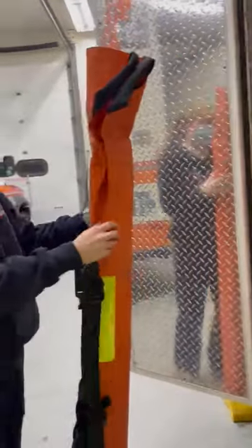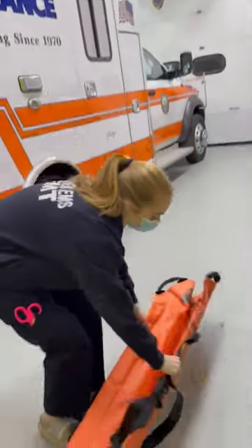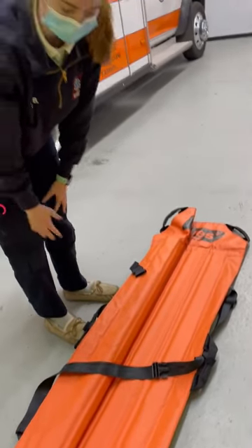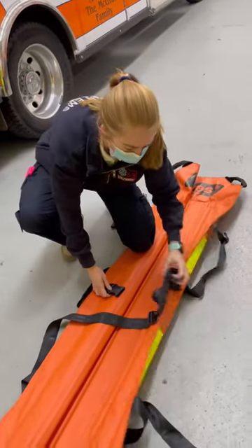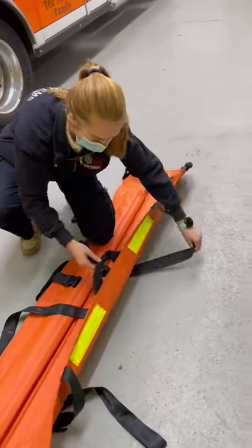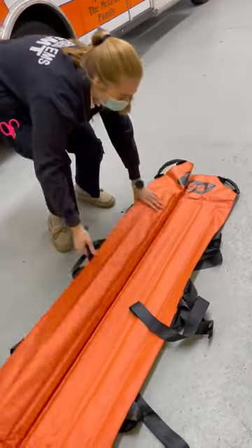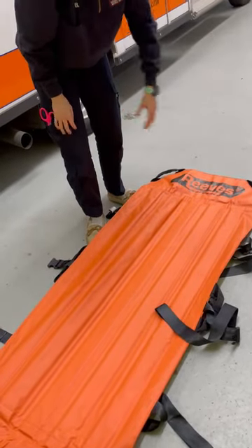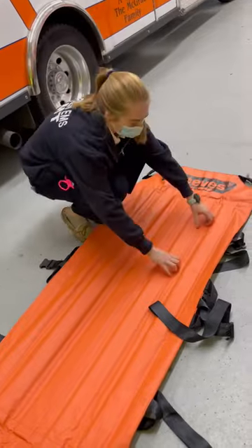So just quickly, how you set it up — it's very simple. You lay it down next to wherever you're going to be moving your patient from. You unbuckle the straps — usually there's one main buckle, but make sure they're all undone and out from underneath the patient. Then fold one side in, underneath.